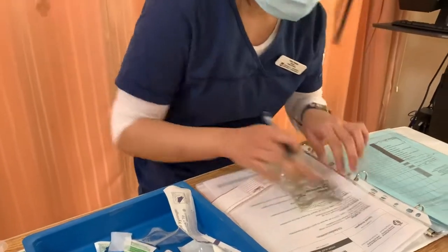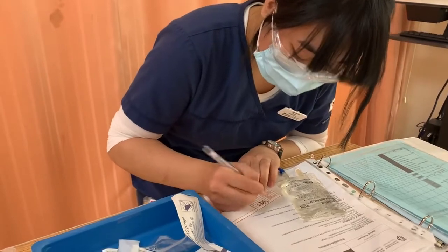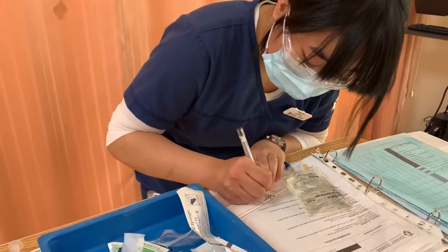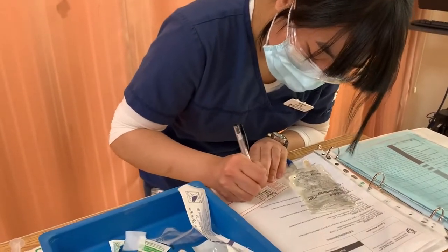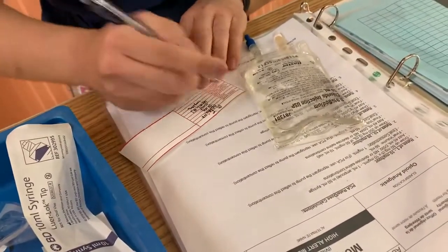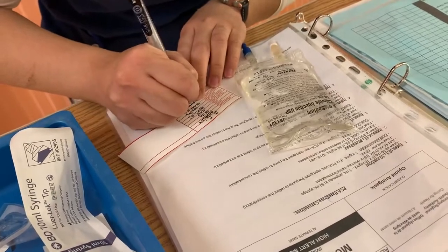The dose for that, according to our PDM, the total dose in the bag would be 50 milligrams. The volume would then be 5 times 1 ml, which is 5 mLs. And the diluent is 45 mLs normal saline. The concentration per ml is 1 milligram per ml, which is exactly what we need. The date and time is today and now, and the signature is my initials.